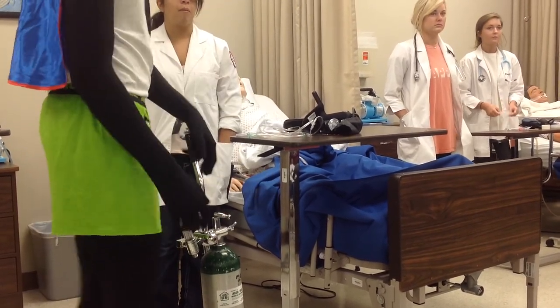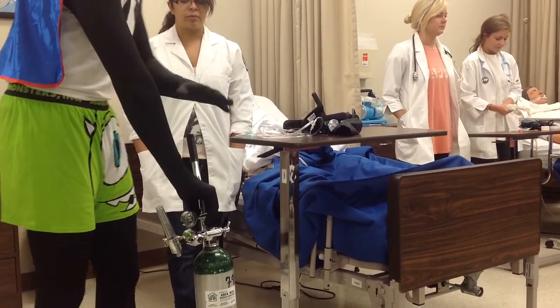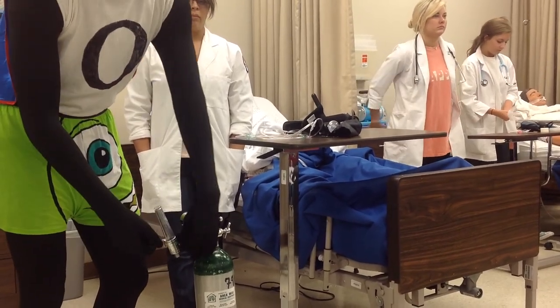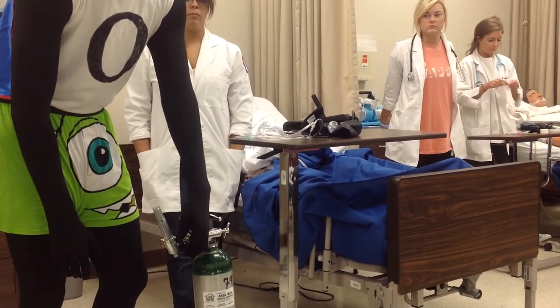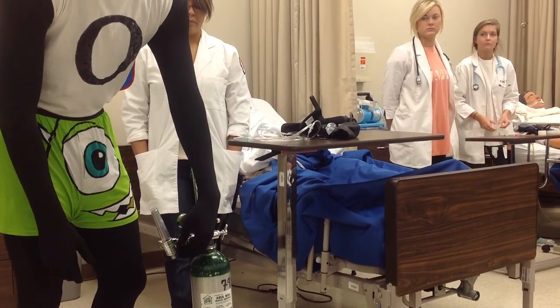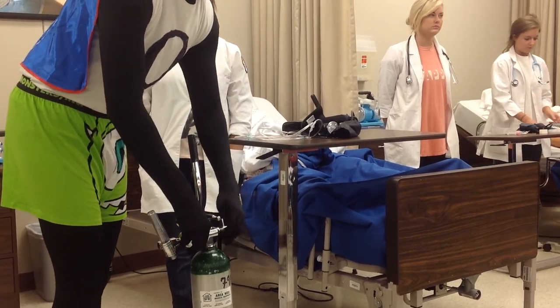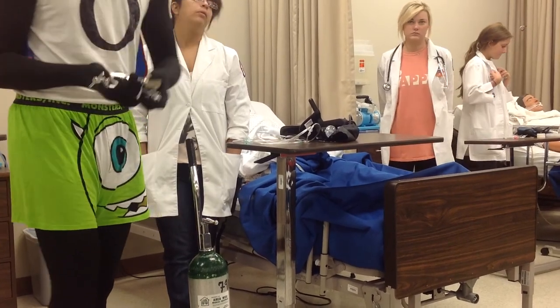Could you do that again? Sure. After you have it on, of course, you want to turn off the oxygen first, and then you let the remaining air that's in the regulator come out by just turning it at the point where you set the dosage, and you'll hear the air bleed out that way. Then make sure it's all out, tighten it, make sure everything's closed, and then you can go ahead and take off your regulator. And that's pretty much it.